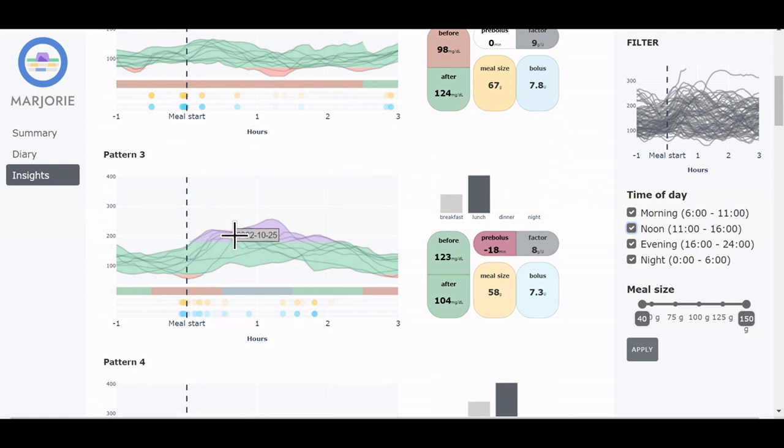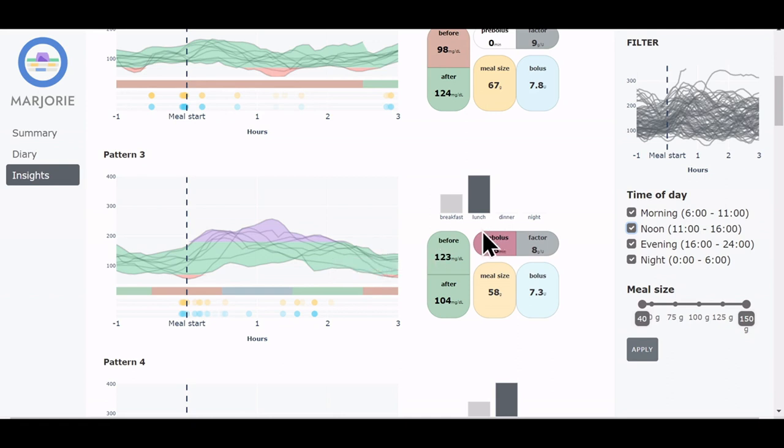We also immediately see a possible explanation for the increase when observing the pre-bolus time here. On average, the insulin was injected 18 minutes after the meal in this pattern. So a consideration for the patient would be to administer the bolus earlier.